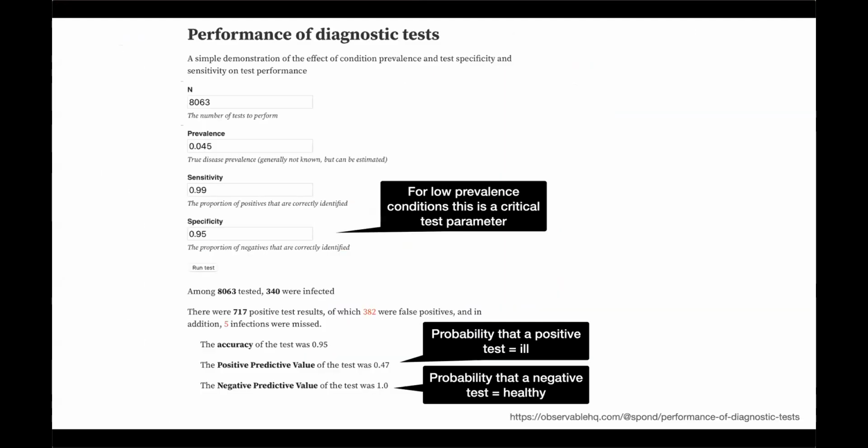Now, if you had an infection and you no longer have viral RNA in any appreciable quantity, then the nucleic acid test won't be able to tell you. But the test itself doesn't really care if you're symptomatic or asymptomatic. The key is how much virus you have.